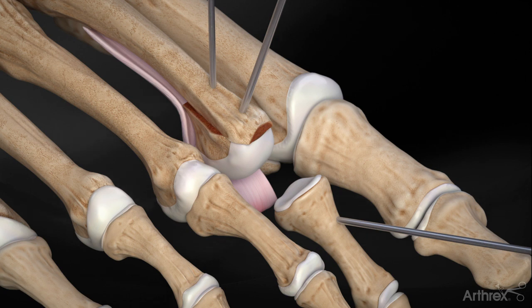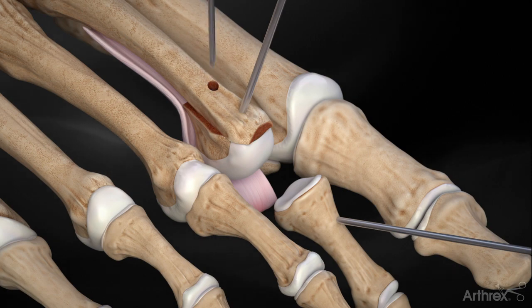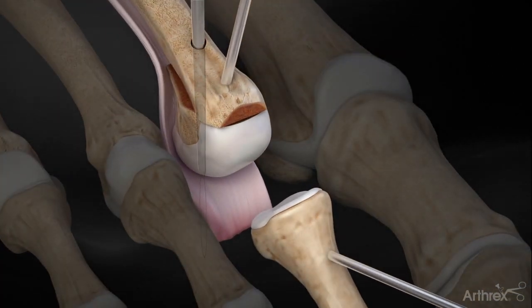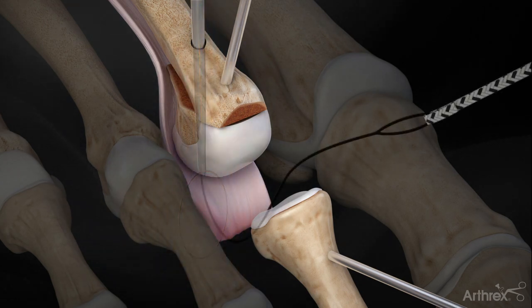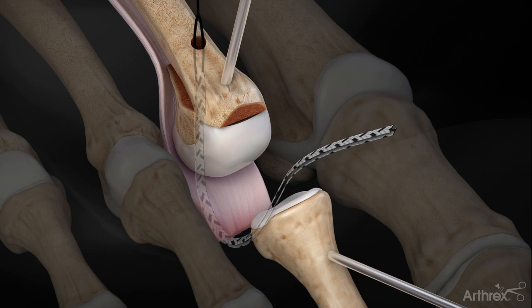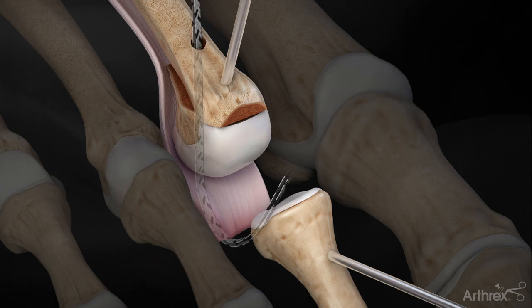The 2.5 mm cannulated drill is used to drill a bicortical bone tunnel in the proximal phalanx. Feed the straight microsuture lasso through the metatarsal tunnel and puncture through the plantar plate. Shuttle the suture passing wire through the lasso and retrieve the wire at the joint through the dorsal incision. A doubled-over labelled tape suture is fed into the suture passing wire and shuttled through the plantar plate and metatarsal tunnel.